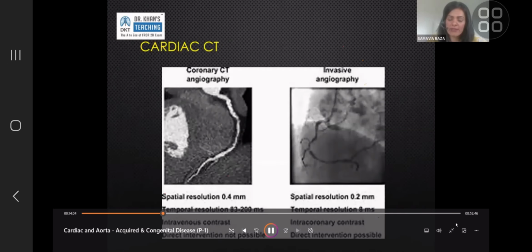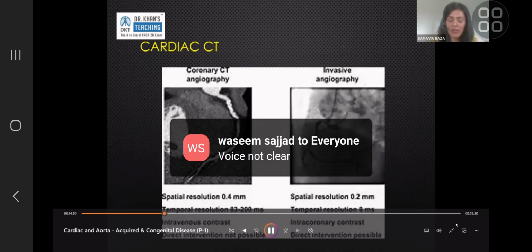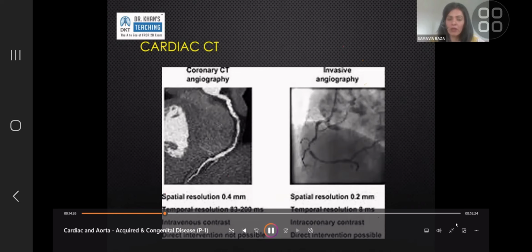Moving on to cardiac CT specifically, for the next 40 to 50 minutes I'll focus on how you acquire images. I don't want this to confuse you too much, so I'll try to keep it as simple as possible. But it is a basic introduction to how images are acquired, so you can have a baseline knowledge should you be interested to pursue it further.